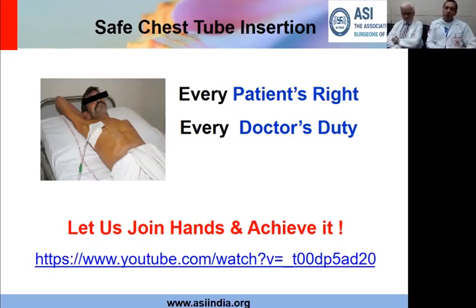Now, if you have a blocked chest tube, the first thing I want to tell everyone is there is no role of flushing the chest tube. Please, friends, be very clear. Sometimes I have seen people taking a 20 cc syringe, filling it with saline and pushing the saline. I've seen people taking an asepto syringe, connecting it and flushing. You will introduce infection from outside.